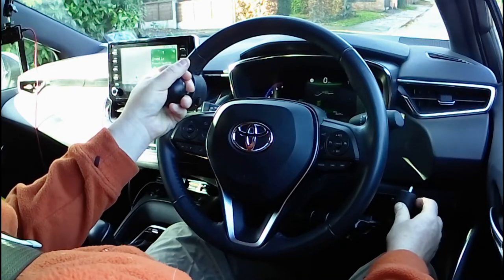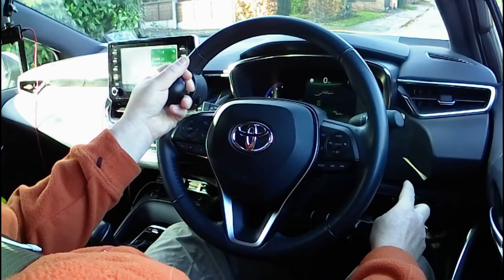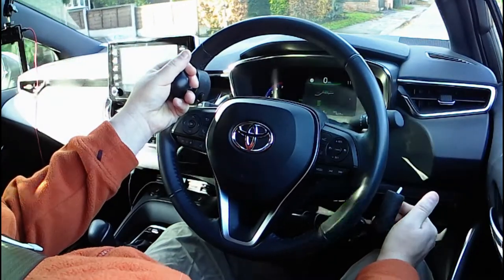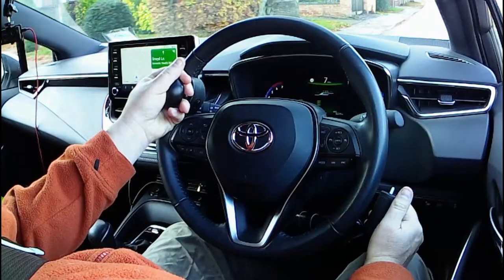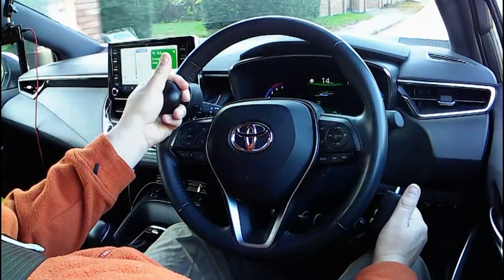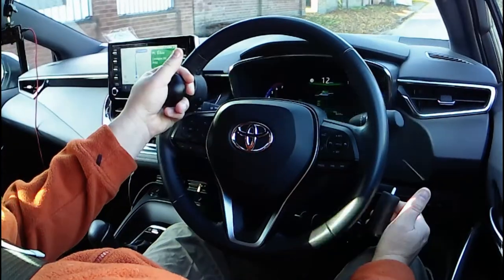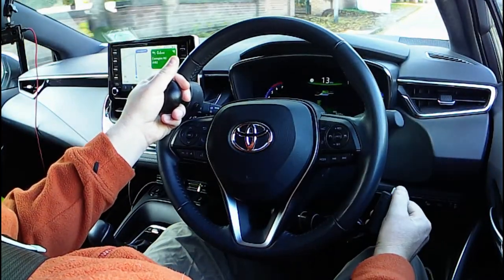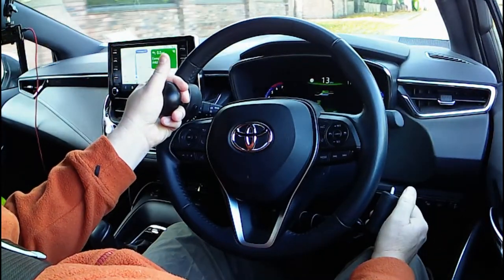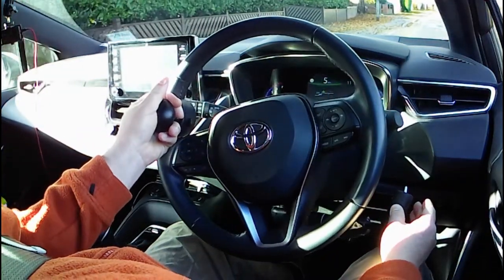So when I've checked it's safe to go, I can use the switch on top of the hand control to signal right, use a little bit of creep from the car, and then pull the control to accelerate. I can then ease off just by relaxing my fingers to control the speed quite accurately. And then when I'm ready to stop, I can use the push-pull hand control switch to signal, and gentle pressure from the thumb to brake.